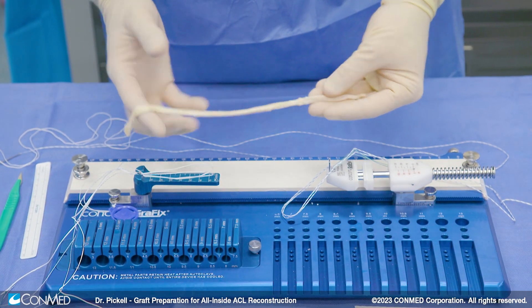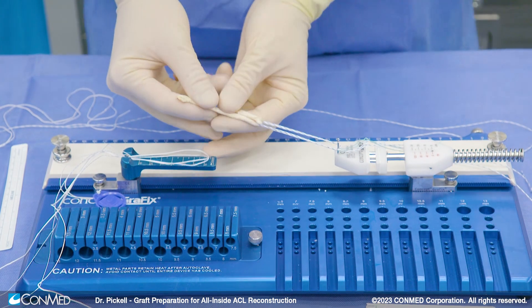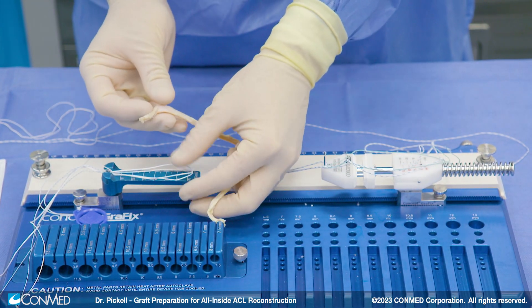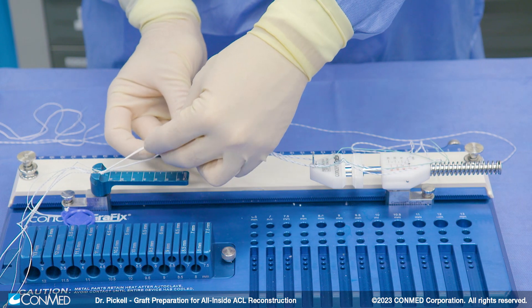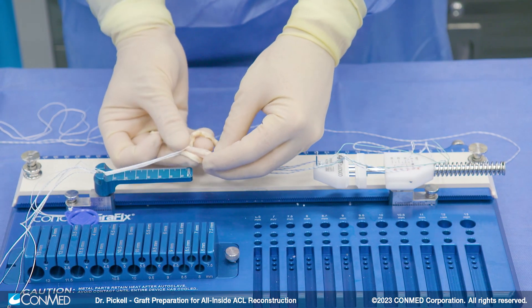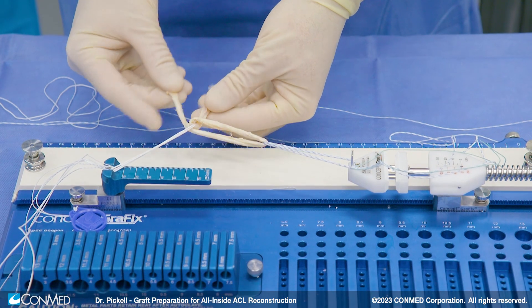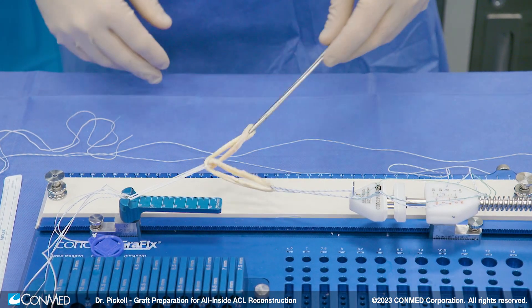Once we've got our graft, the next thing we're going to do is loop it through one end of our button system. Now we've got our graft through our loop with one end on either side. There are a whole bunch of ways to do this — this is my system — but essentially we're trying to turn this into a four-strand graft. I put one end of the tendon through the loop of the femoral button and then pass the other end of the tendon through the loop in the opposite direction, so we've got one going one way and one going the other way. That's going to add friction to our system and give us a more secure and robust fixation. Once we've done that, you have to pass one side of our tendon through the center of our graft, so now we've got both tails on the same side. We match up our ends and put a clamp on to secure them, and now we've got the beginnings of our graft.